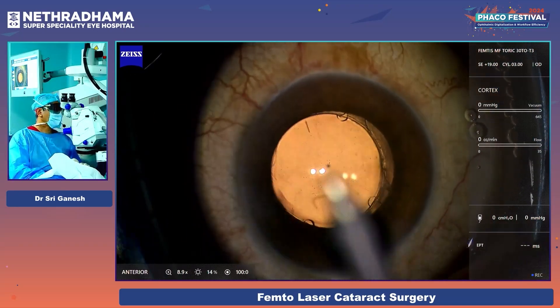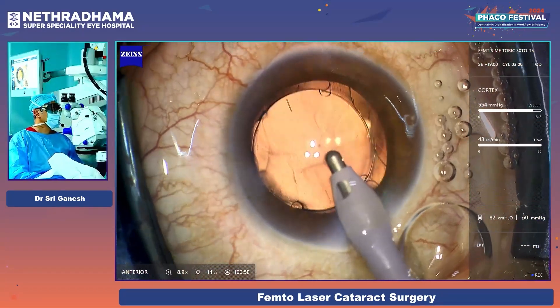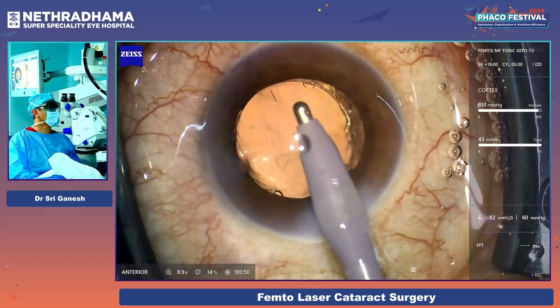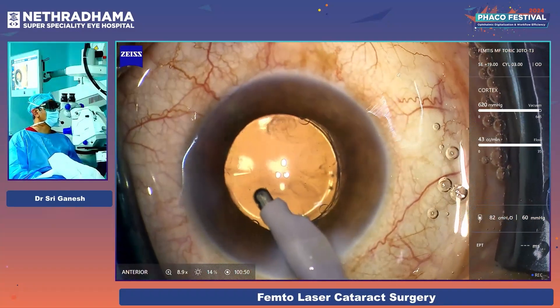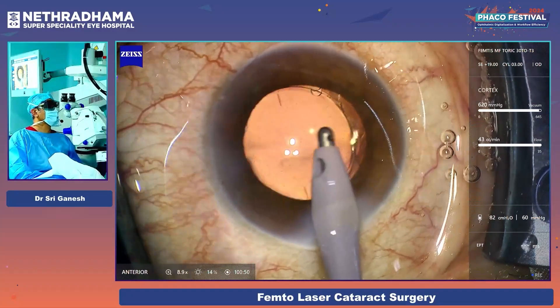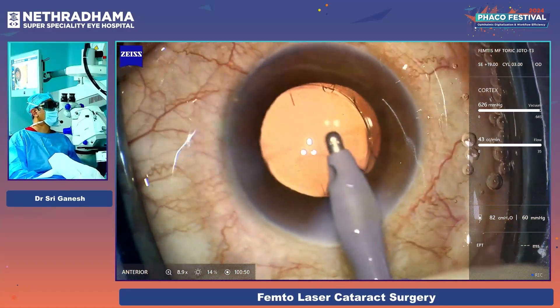Now I just have to evacuate the visco from the anterior chamber. There is nothing under the lens — no visco under the lens. Once you remove all the viscoelastic from the anterior chamber, you can see that the lens does not rotate at all, even with the high flow rate of 90.